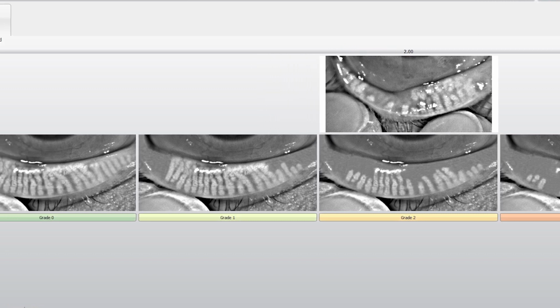And at this point, the only thing left to do in my exam is debridement of the lid margin and expression, and I do that at the slit lamp. Once the process is completed though, I rank my contributing issues according to their severity, and then I check the boxes as to what treatments I want for that patient.